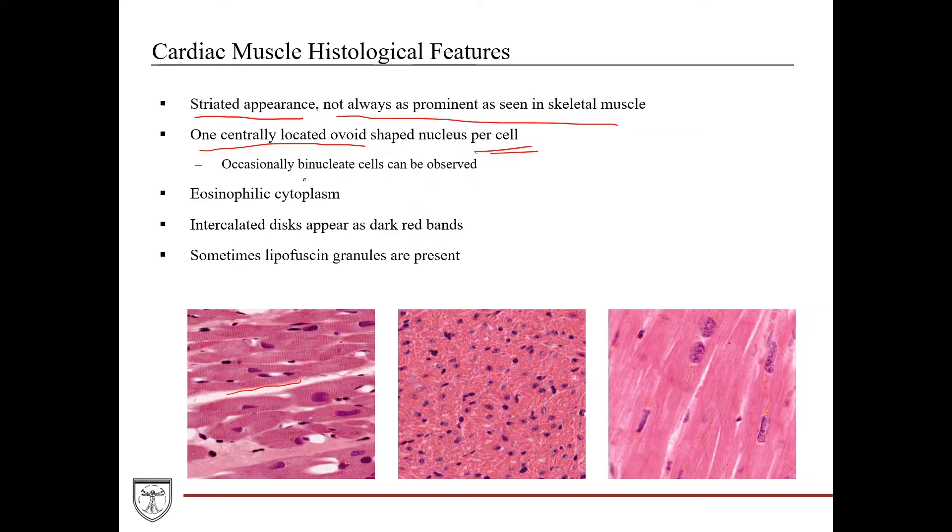Cardiac muscle cells have one centrally located ovoid-shaped nucleus per cell, usually. Sometimes, occasionally, they'll have binucleate cells where you'll have two nuclei, but usually it's just one per cell. And again, unlike skeletal muscle, they're located in the center, not in the periphery like skeletal muscle, and they're round-shaped.